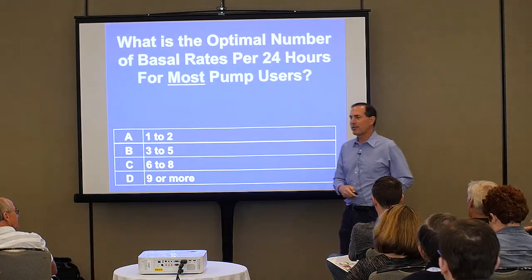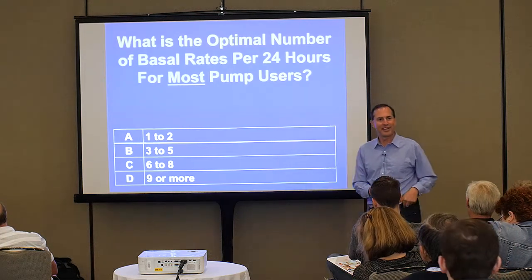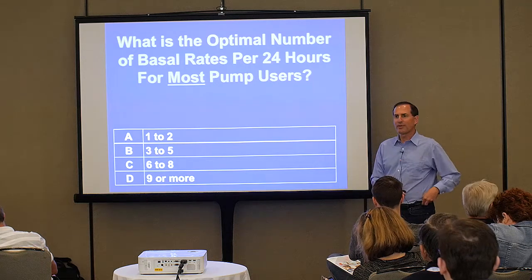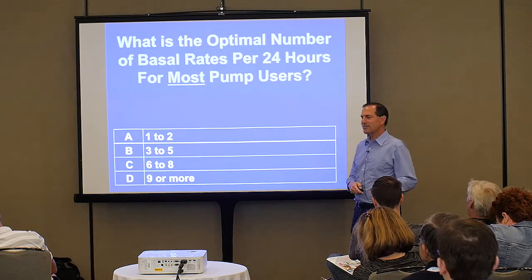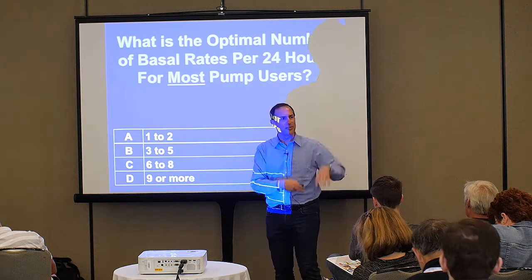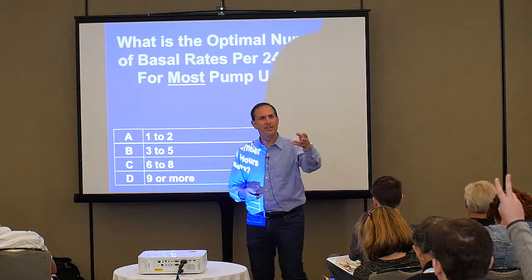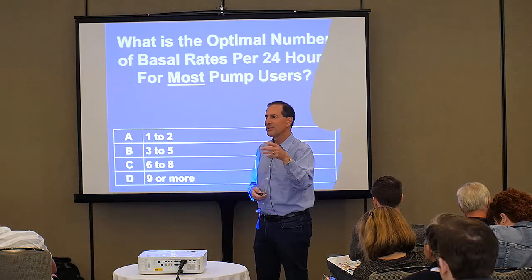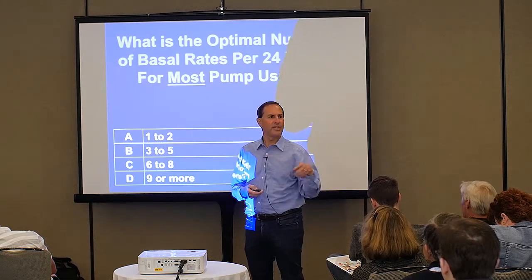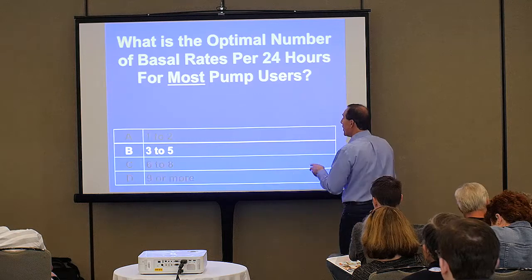Okay, so before I continue, I want all of you to go into your pump right now and see how many different basal rates you have set per 24 hours, unless you already know off the top of your head. No, not temporary, just what you have pre-programmed. I'm not talking about exercise, just your default. How many do you have? 2, 3, 2, 4, 7, 5. The last group had a lot more basal rates. I'm not sure who wins.